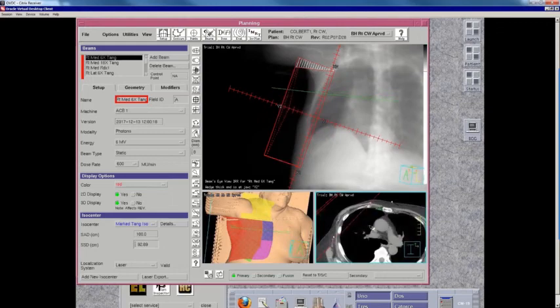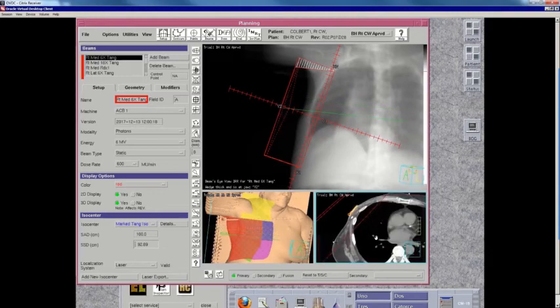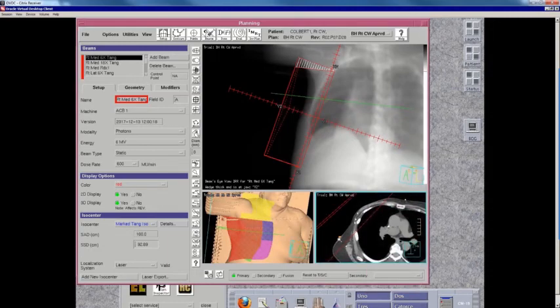I would point out, so let's get to the slice with her. So this patient, this lovely patient, is shaped like many Texan women, and her scar comes all the way out to here. So if we wanted to cover her IM nodes, which I would say if there's anybody you should cover them electively on, it's this patient with N3C disease. If you're not going to use electron photon technique and you want to cover that scar, this is what you got to do.